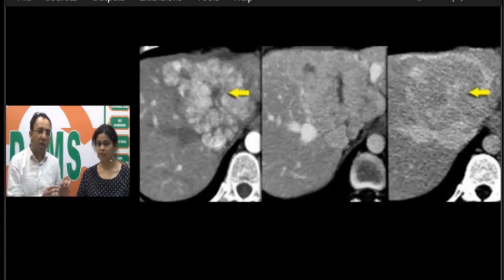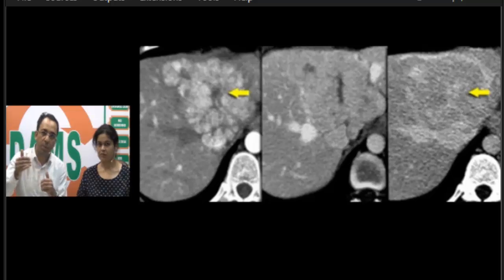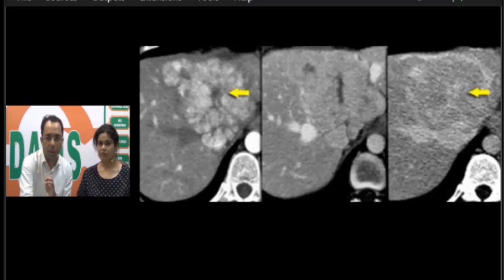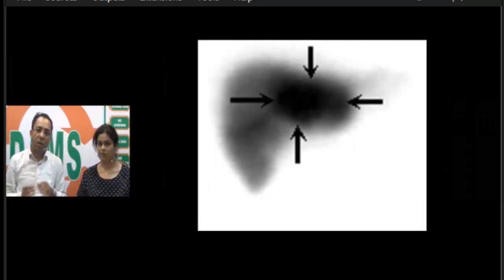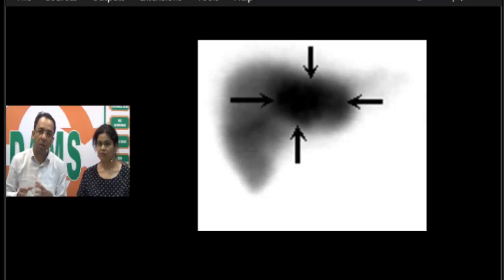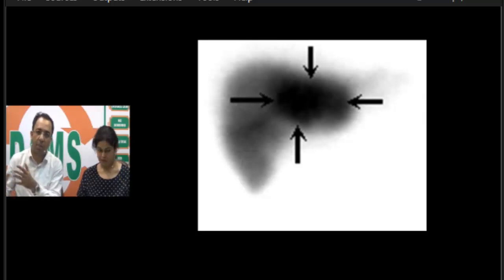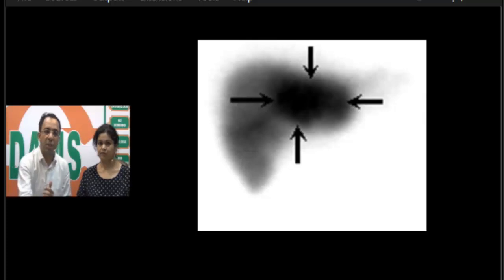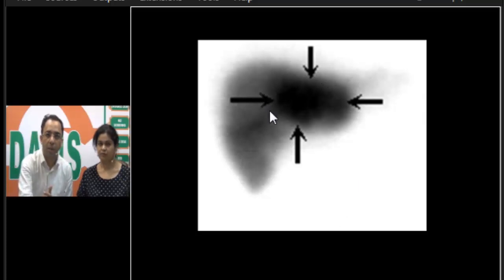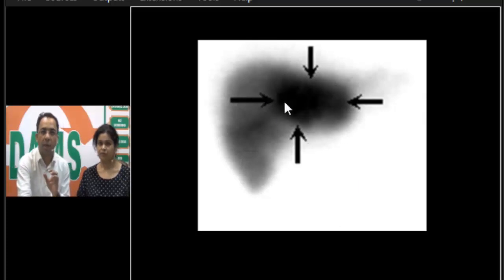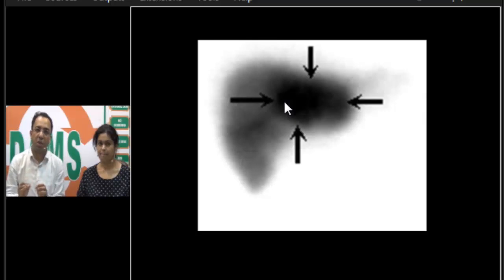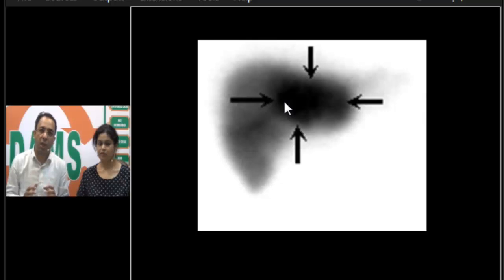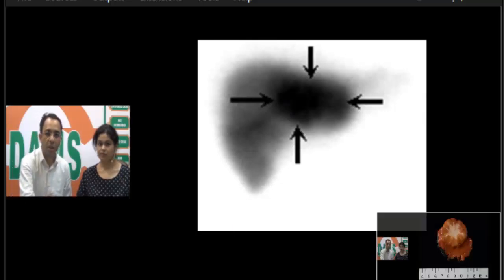These lesions are rich in Kupffer cells. When we do a technetium sulfur colloid scan — which is taken up by the reticuloendothelial system, by macrophages, by Kupffer cells — FNH lesions show high uptake. You can see the high uptake on the technetium sulfur colloid scan. These are the radiological characteristics and differential diagnosis of FNH.